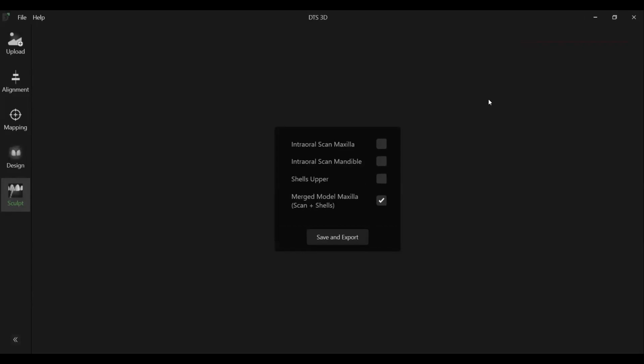So let us see. I will just try to share my screen here and see where my file is, which I just exported.